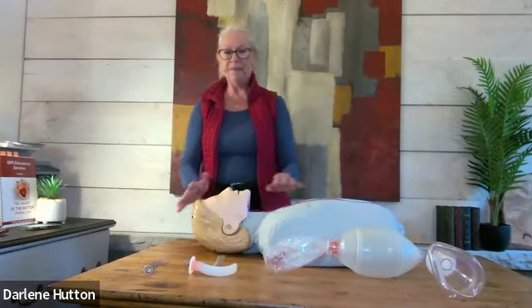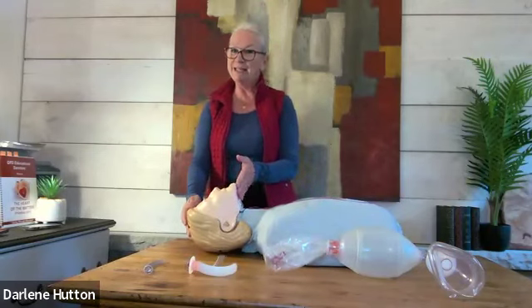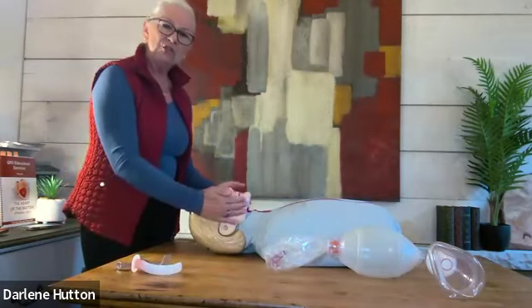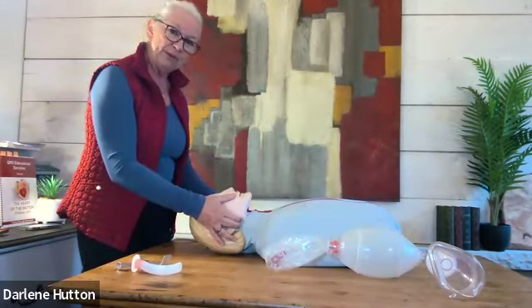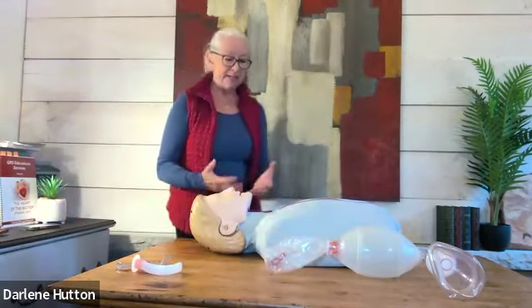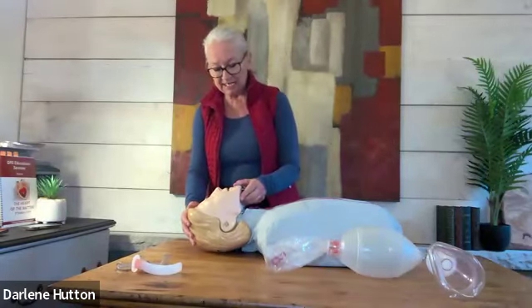If this patient was a trauma patient and I was concerned about potential C-spine injury, I would not do a head tilt chin lift. Rather, I would do a jaw thrust. In a jaw thrust, you're going to take the angle of the lower jaw, the mandible, and push it upwards while with your thumb keeping the cheeks down. This is not a trauma patient, although with no arms and no legs, you kind of wonder sometimes. But anyway, head tilt, chin lift, I see no obstruction.